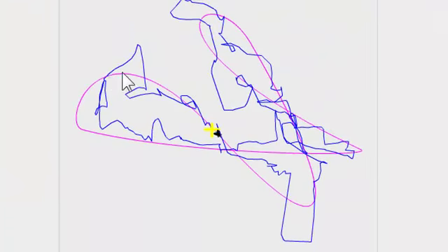Secondly, the trajectory of the fly pattern and the pattern traced by the patient is displayed graphically after the exercise trial is finished to visually express the patient's amplitude accuracy. The blue color represents the path traced by the patient. After 1 or 2 weeks with daily or every other day 15 minutes of training, reassessment is performed, which will decide whether the patient can start on a more difficult stage in the exercise program.